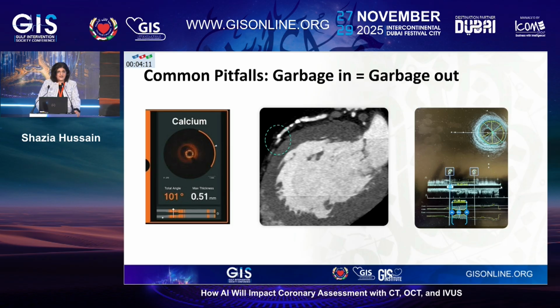If you look at the second image of the CT, there looks like a potential lesion there. For most of us, we'll know actually there's an artifact there, but unless you've looked at the images, you won't notice that there's a line artifact through there, and that is an inaccurate result. So that may come up as an FFR of 0.5. But you do need to assess the images.